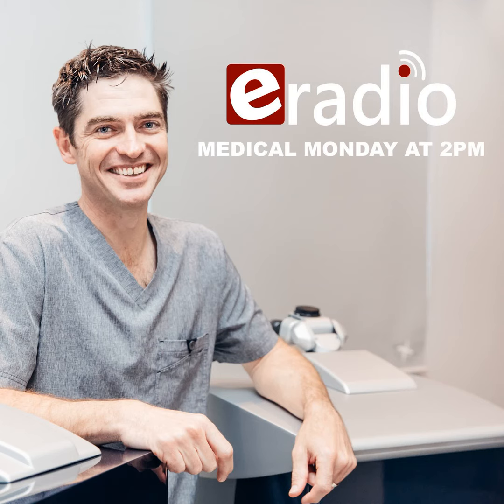And what we do now is we can actually measure the thickness of the epithelium. As I said earlier, we can tell the laser to remove that and remove the scar to get a better optical shape and to hopefully improve their visual outcomes as well. So if you've had radial keratotomy and you've thought it's the end of the road and you're left with poor vision, see an ophthalmologist, see a refractive surgeon, and see what your potential options could be to try and improve the shape of your cornea.